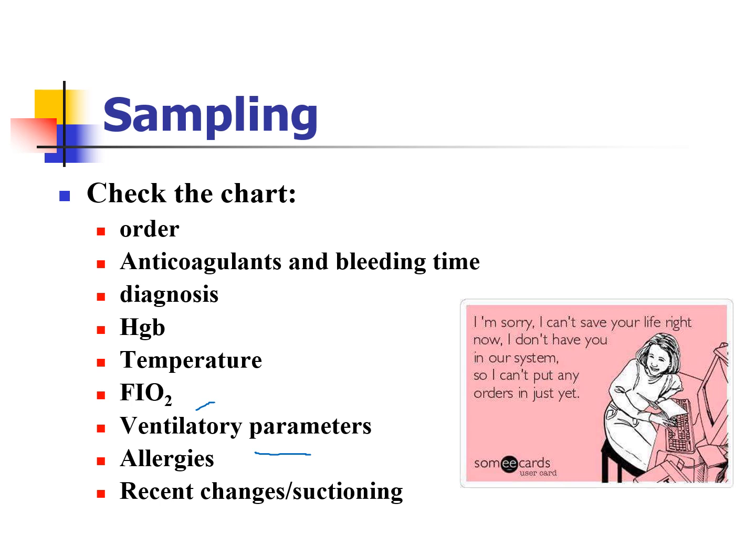Anything we're going to hold pressure, betadine for wiping off the site. Recent changes in their status, if they've been suctioning the patient's lungs, that obviously can be a change there because you're sucking gas out of their lungs and therefore they might be more acidotic. Or let's say they've been suctioning gastric contents. Well, that means you're also suctioning gastric acid, which means they're more likely to be basic because they're losing an acid. That can throw off the blood gas results as well. So those are all things that you just need to be charting. Charting will save your life.